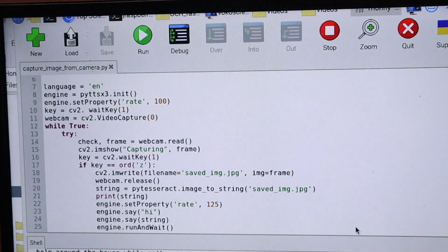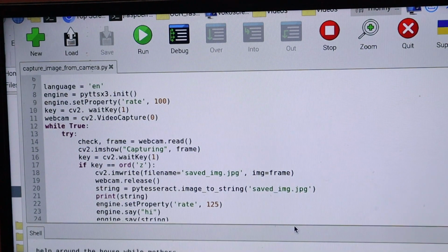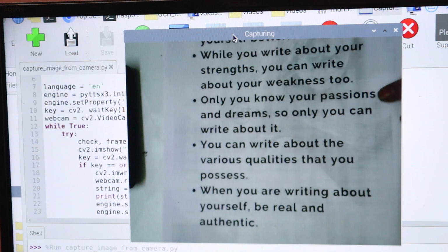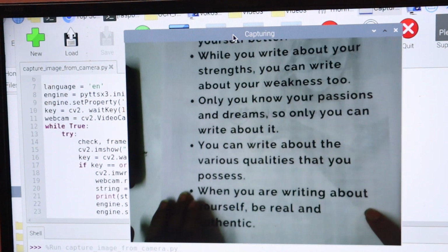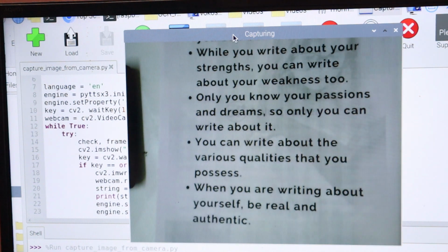You can see once I press the Z button, it starts speaking the same sentences which are present in the image. In this way you can run this project. Now I will place another image so that it will show how the project works correctly at runtime. That shows the accuracy of this project. You can see I will place this page again, and then I press the Z button again.